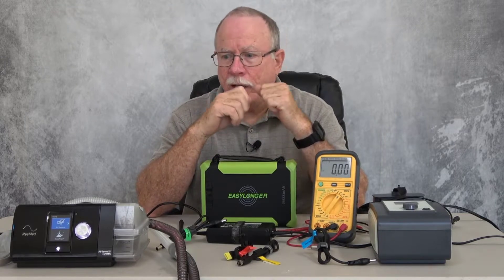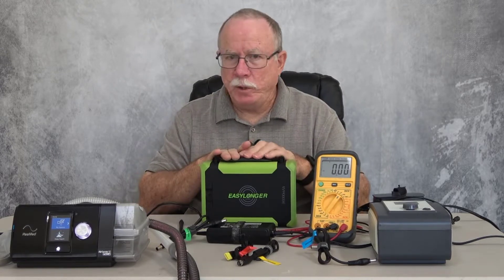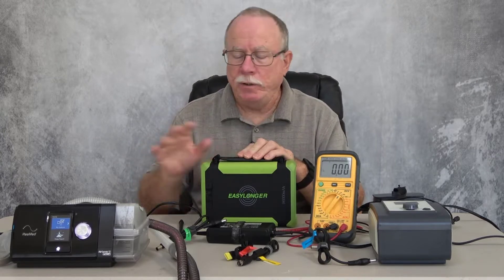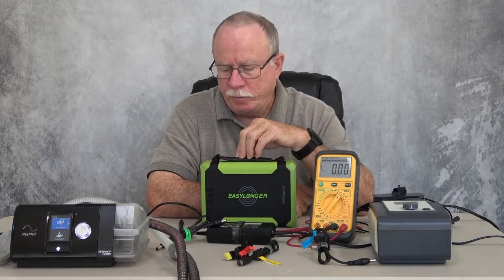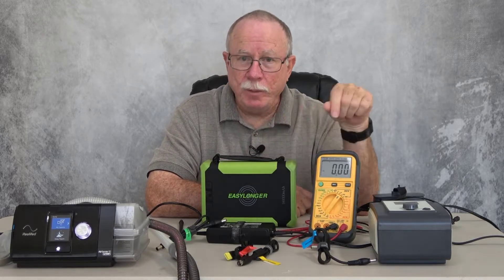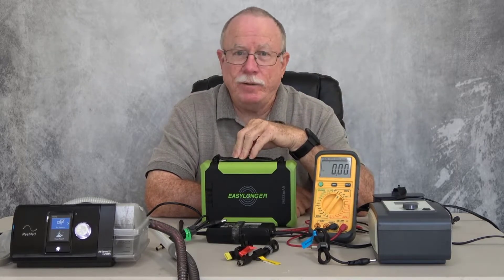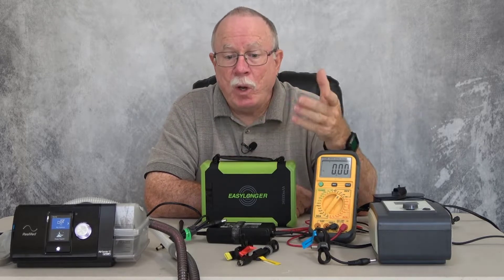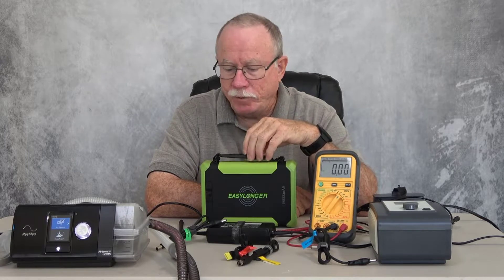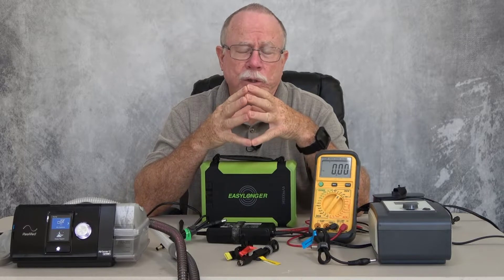In this video I want to show you how to set the voltage for your CPAP machines. I've got two different CPAP machines up here, but most importantly how to know from your CPAP machine what the voltage should be, because obviously you can't set the output unless you know what it should be. There are actually two ways you can find out what that voltage should be.